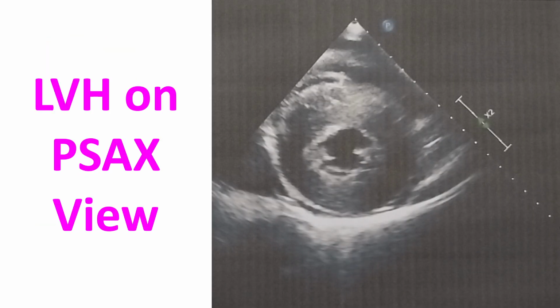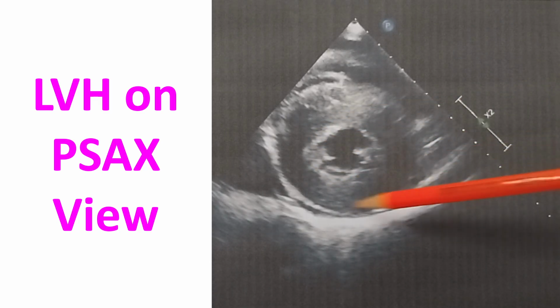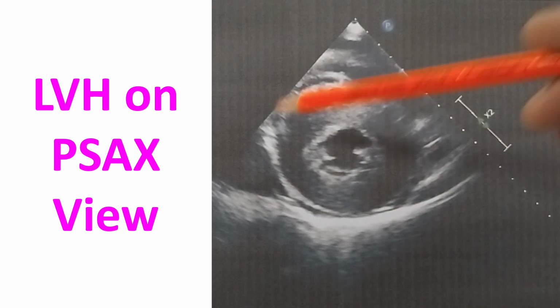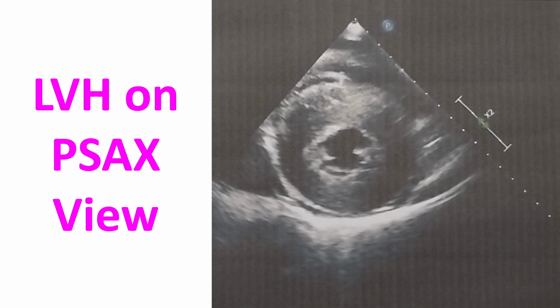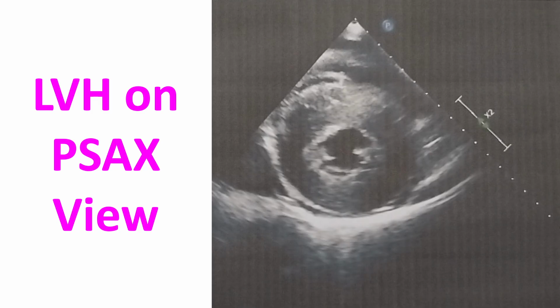Parasternal short axis view, perpendicular to the previous parasternal long axis view. This is the cavity of the left ventricle, and this is the thickened septum. Here also you can see that the edges are better seen than the inner portion of the myocardium. You can see the cross section of the papillary muscles on either side. So this is a cross section at the papillary muscle level.